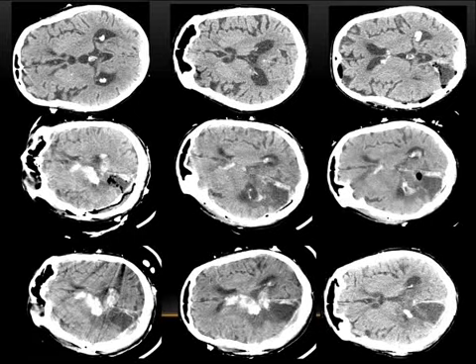There are 4 different types of scanners: portable scanners, PET-CT scanners, MDCT scanners, and so on, 16 slice, 64 slice, and so on. Now I ask you, and I've done this test with radiologists in our practice, which is the highest dose scan and which is the lowest dose scan? And they look at it and say, oh, there's more speckle in this one, and there is more noise in the other one. But if you look at the scans individually, what is offensive about some of them has really nothing to do with the speckle in the image.